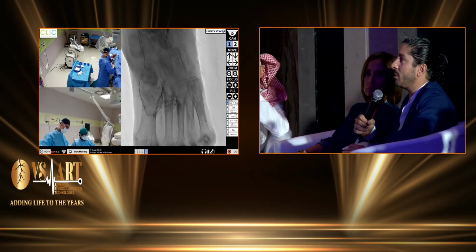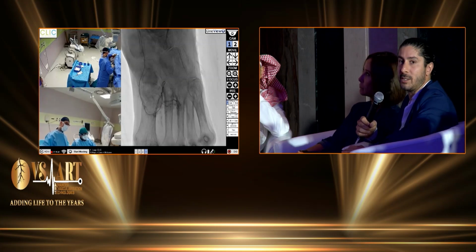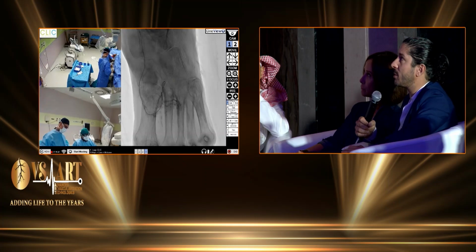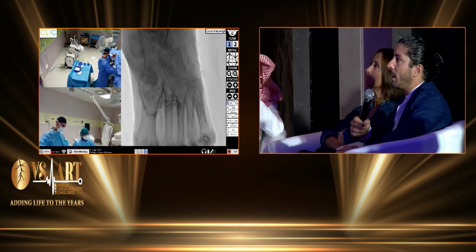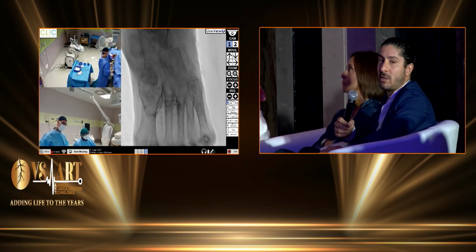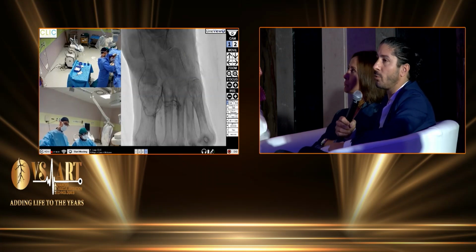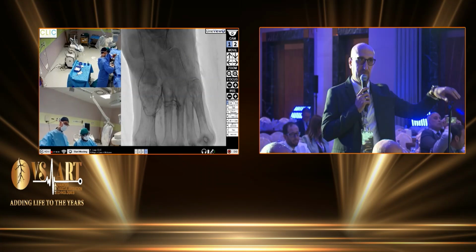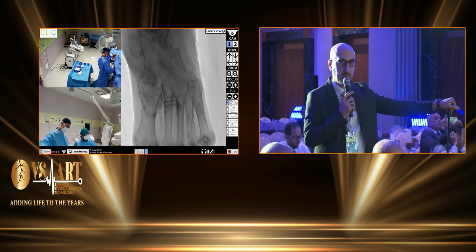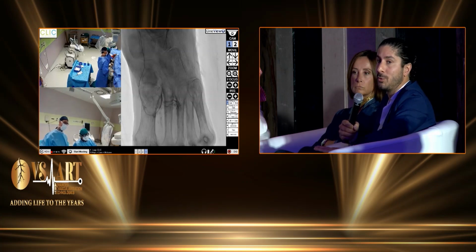This is a good question. I don't believe that we have a long dissection, just a long subintimal recanalization. That is different because the subintimal space is a new lumen, less prone to calcification or anything else. It's new, clear, no thrombosis, no material inside this new lumen, but for sure prone to recoil. Yes, related to the calcification, that's the main point, recoil. It's usually, as always, a balance between the inflow pressure and the outflow in the foot.